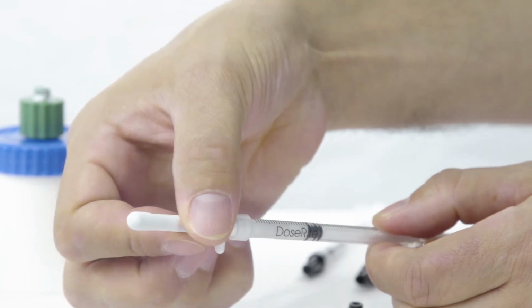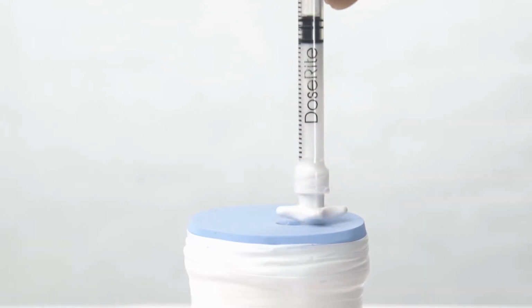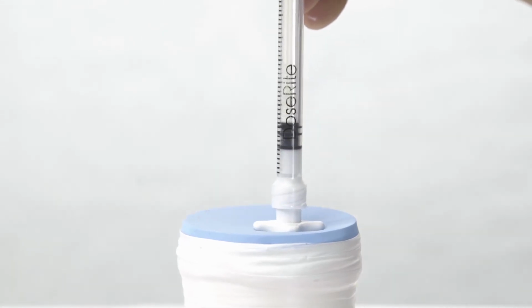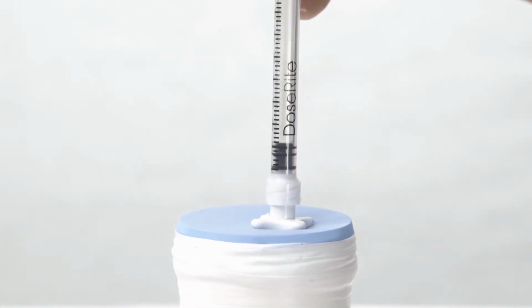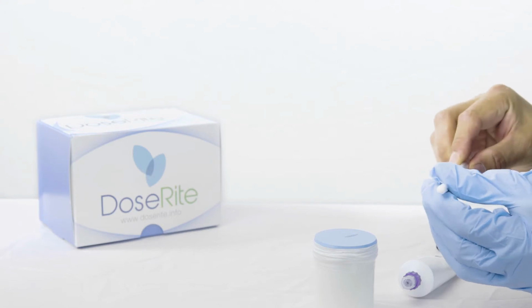Attach disposable applicator tip to the syringe. Insert applicator into the anus until reaching the safety flange. Press on the plunger to apply the medication. Rotate the syringe slightly while removing to disperse medication. Remove applicator tip from syringe and discard.